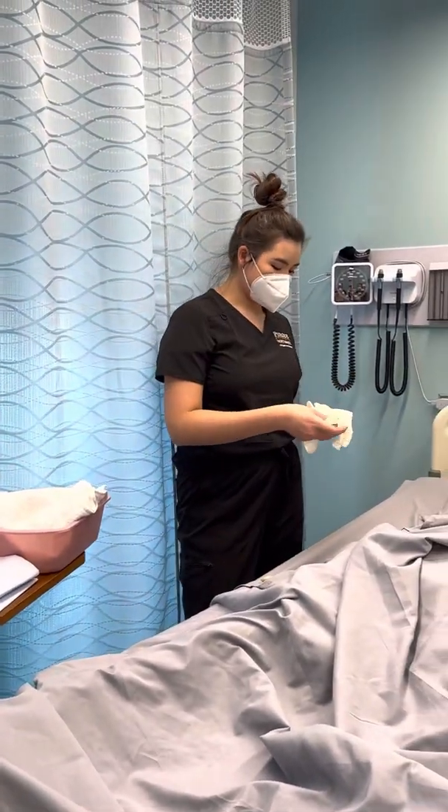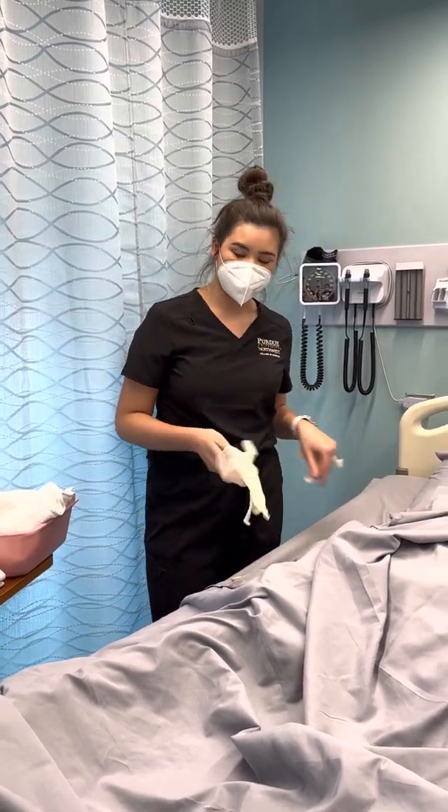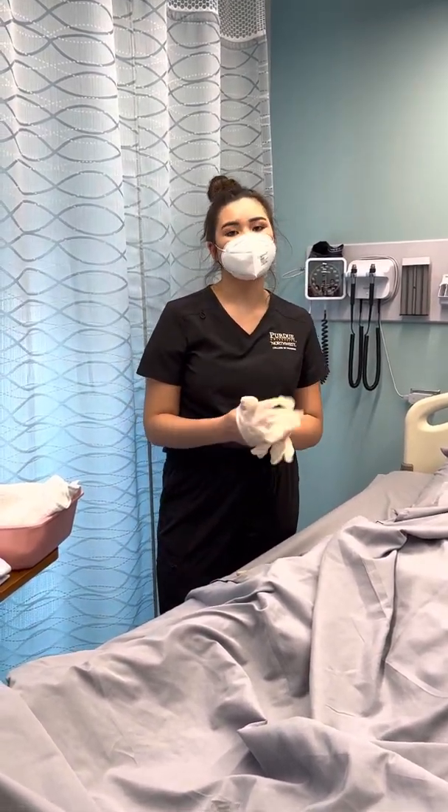I'm also going to raise the bed to a working height, lower down the railing, and make sure I have adequate light. This looks good to me.